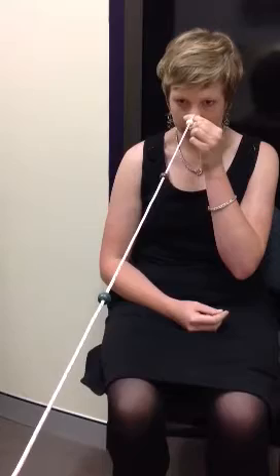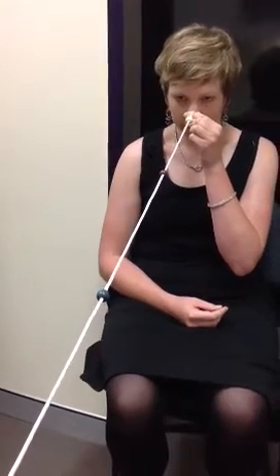This is how you exercise with the Brock string. Hold the string on your finger up to your nose, touching the end of the nose. Hold it fairly tight. The other end someone can hold, or you can put it on a doorknob.